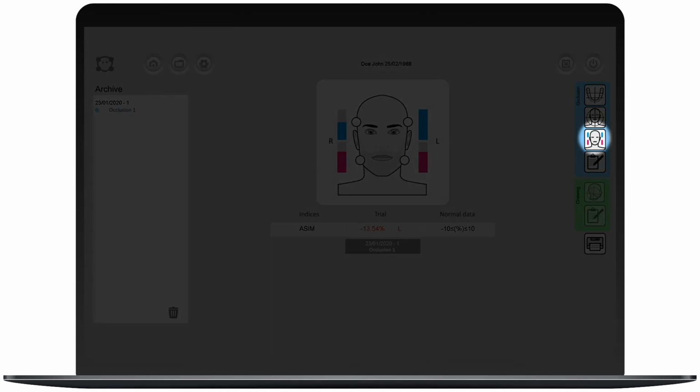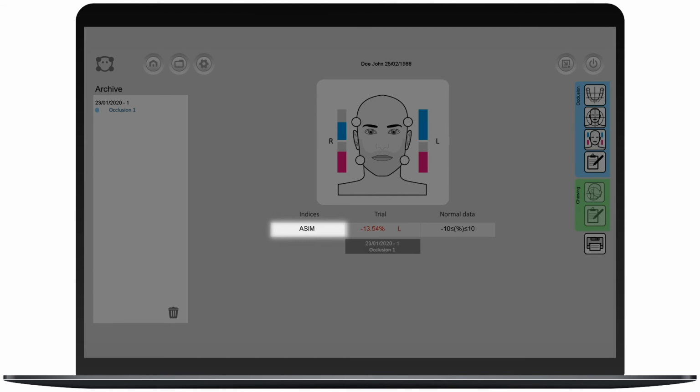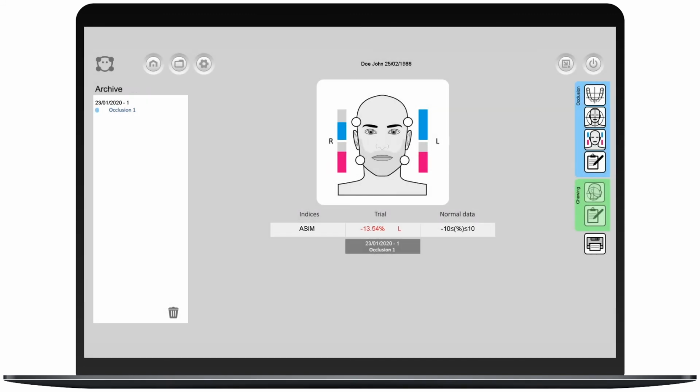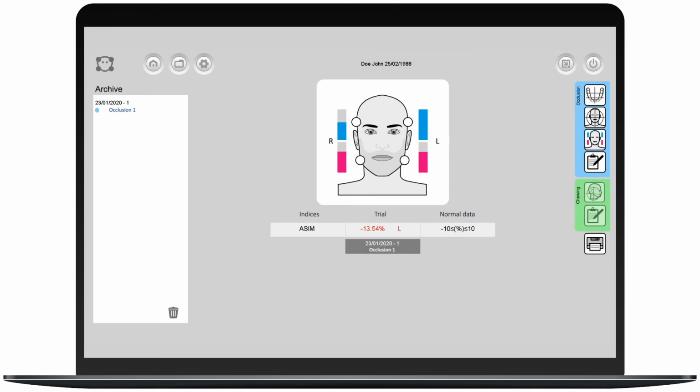By clicking on the third button on the occlusion sidebar, you can analyze the ASIM index, which quantifies the symmetry between the left and right muscles. In this case, we have a value of -13.54% and the letter L. This means that the left side prevails over the right side.